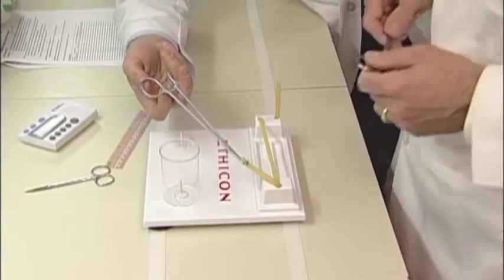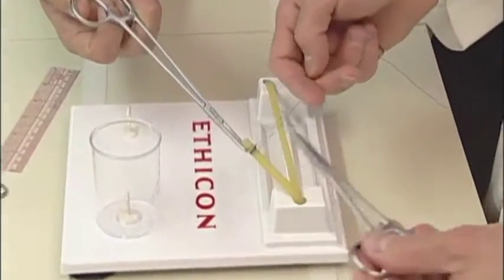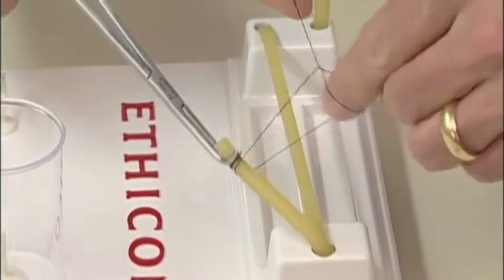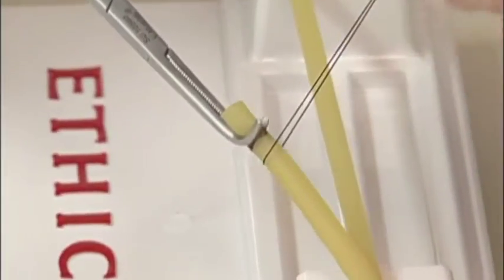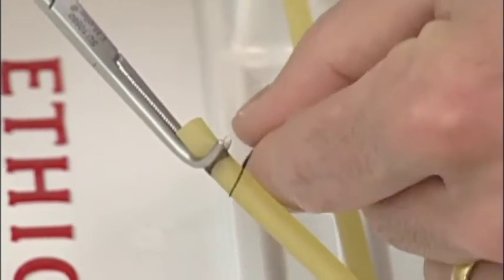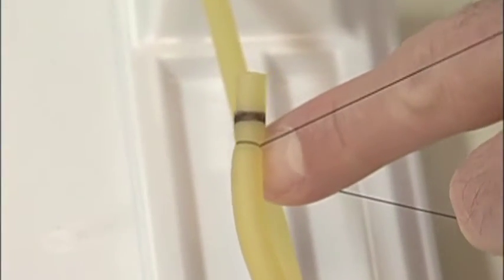We'll now show some pitfalls to avoid. Certainly you need to take care in learning how to pass that clamp effectively and then releasing the clamp from the ligature. You want to tie down this first knot in a square fashion, and as you do you want to pull this up against the clamp. If you leave it down somewhere in a suboptimal position like this, off, and leave it below the target line, it's pretty clear to see that you'll have about a 5mm gap error.